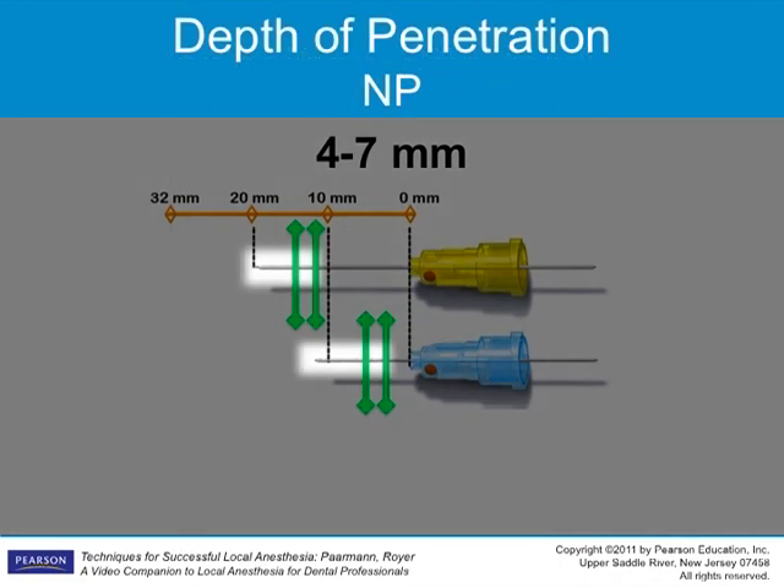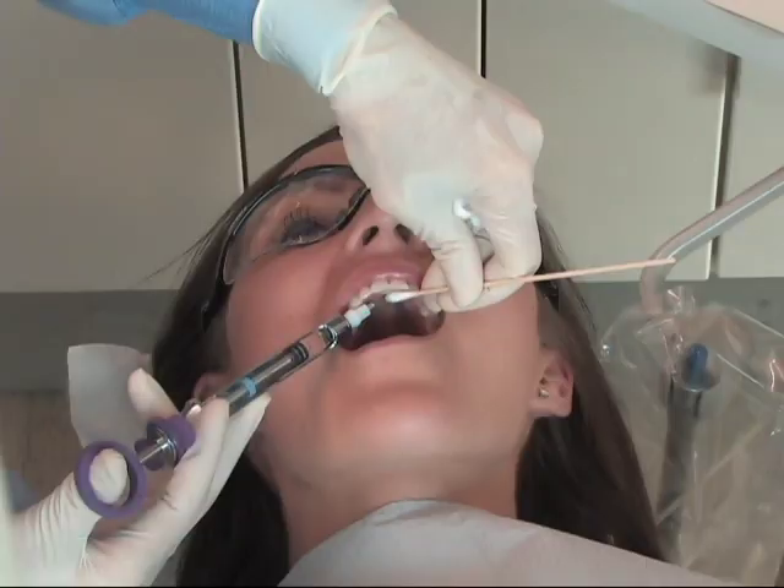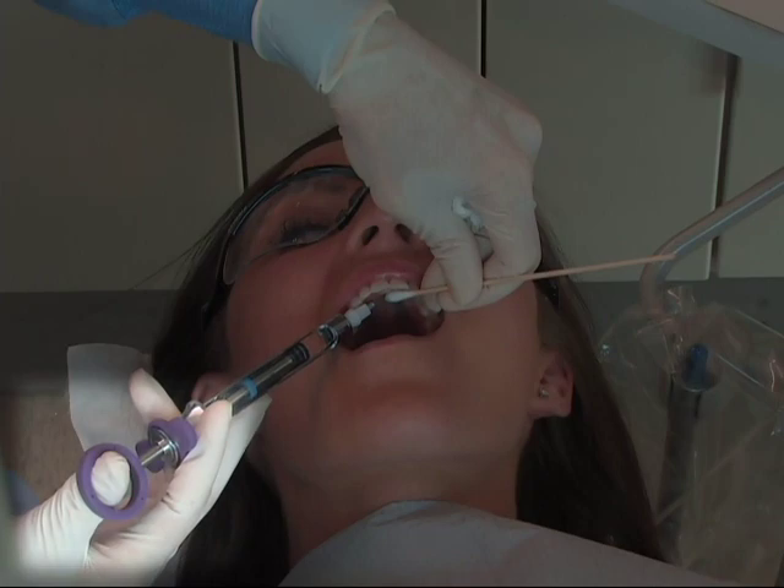The depth of insertion is approximately 4 to 7 millimeters. Cover the bevel of the needle. The needle should remain in the middle of the foramen. Aspirate at the deposition site and drop a few drops of anesthetic prior to removing the cotton tip applicator.